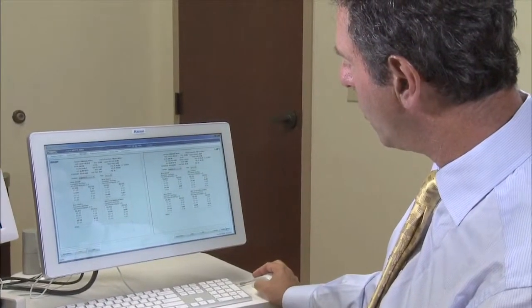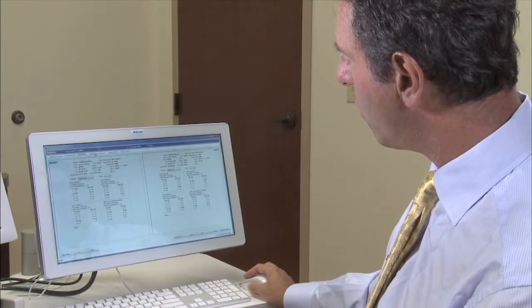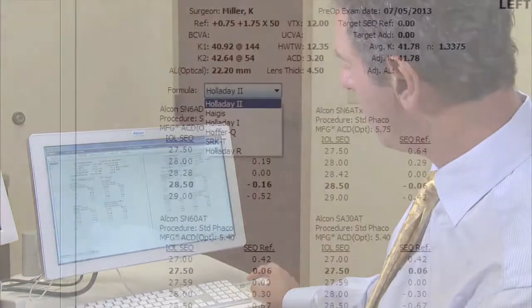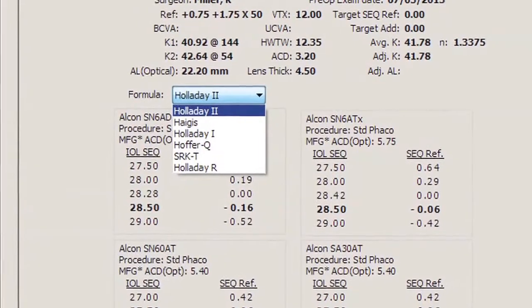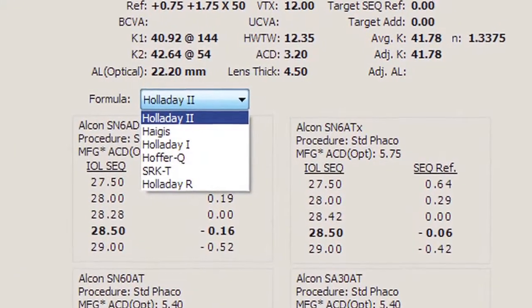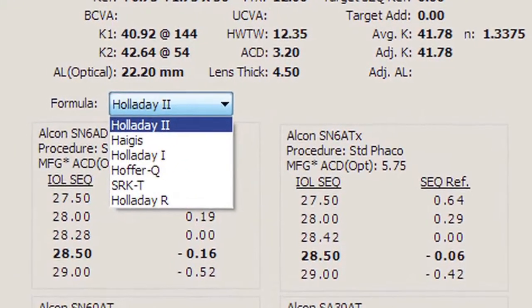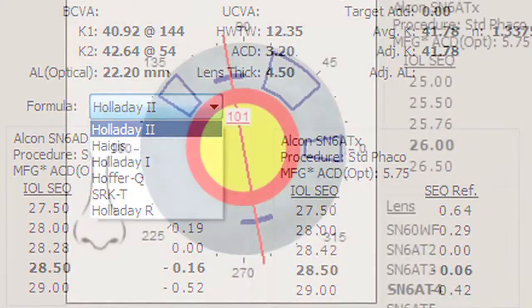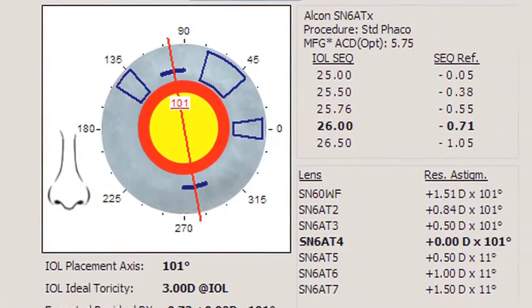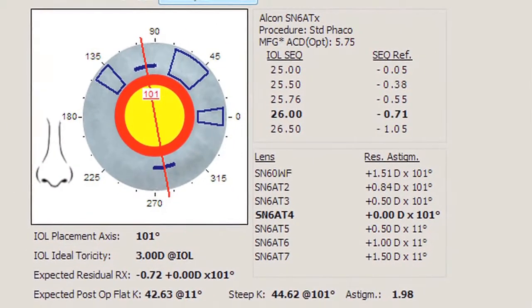The Veryon reference unit allows surgeons to efficiently select the IOL and lens power for their patients by providing multiple established formulas in a simple drop-down format. Most importantly, the Veryon reference unit also provides comprehensive astigmatism management.